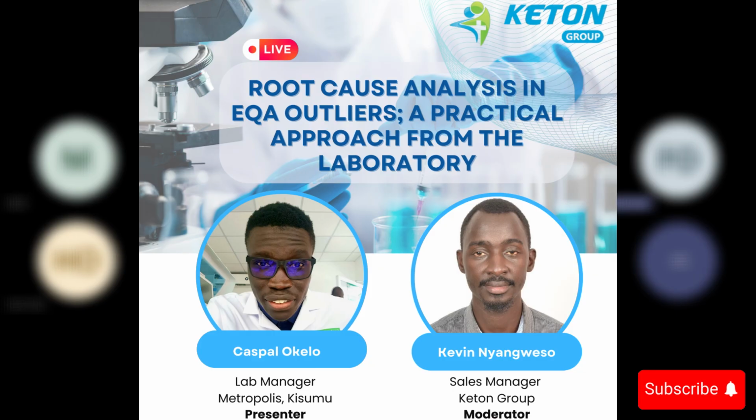Caspal, and what then do you think? The other thing that I expected, this is something I've observed over time regarding the EQA results: guys need to pay attention to the summary, not just pass and fail. They need to pay attention to the statistical values like the Z-score or the SDIs, because that is the catch point. I've witnessed some providers, mostly in biochemistry, for example sodium.